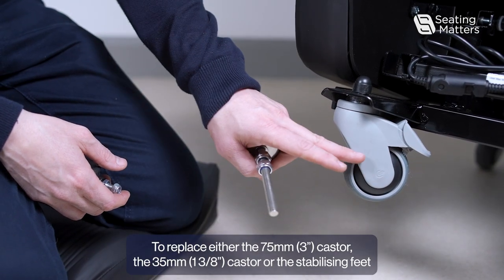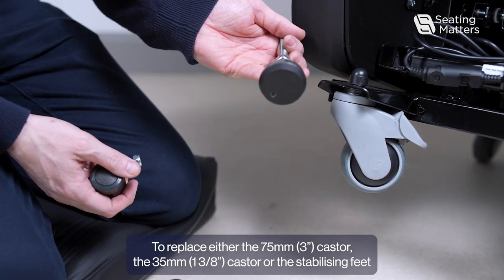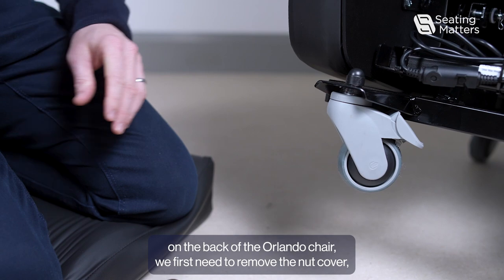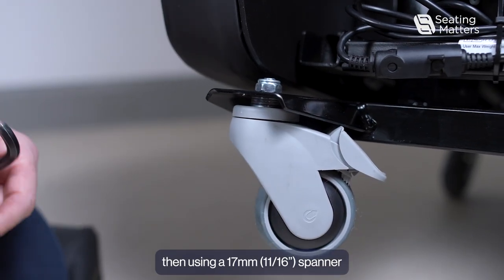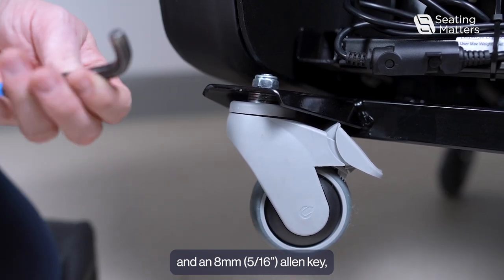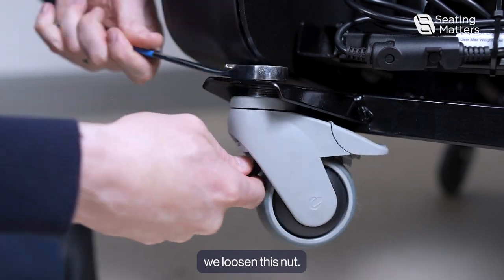To replace either the 75mm caster, the 35mm caster, or the stabilizing feet on the back of the Orlando chair, we first need to remove the nut cover. Then, using a 17mm spanner and an 8mm Allen key, we loosen the nut.